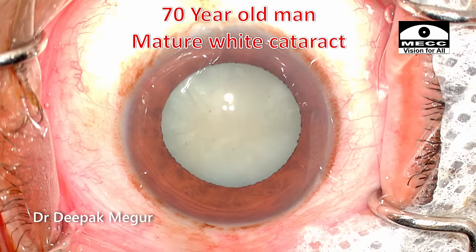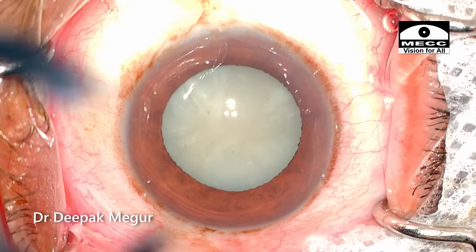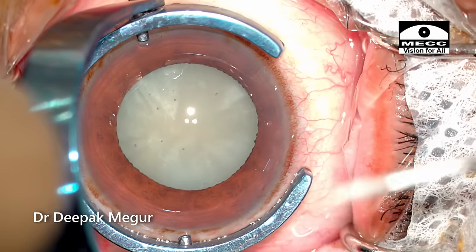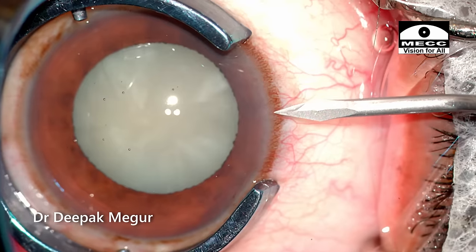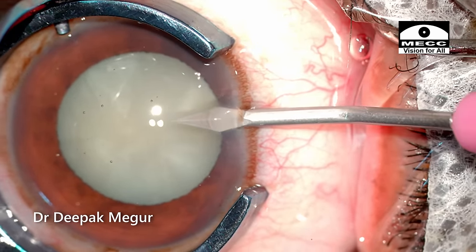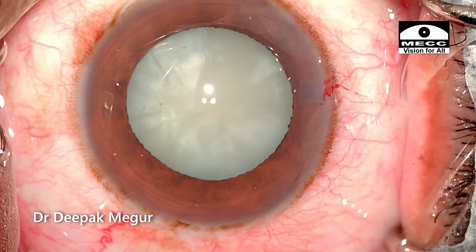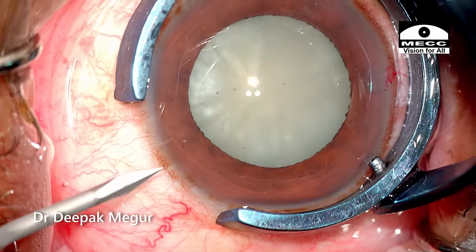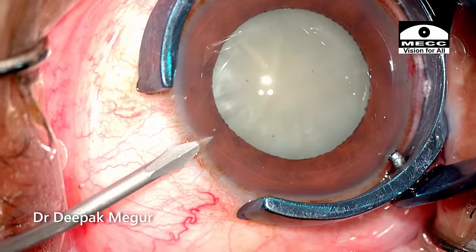He is a 70-year-old man with a mature white cataract. The surgery is being done under topical anesthesia. The side ports are being created. The globe is stabilized and turned slightly away so that I get a nice tunnel. The other side port is created. The incision is based in the limbus and note the intracorneal tunnel as well.